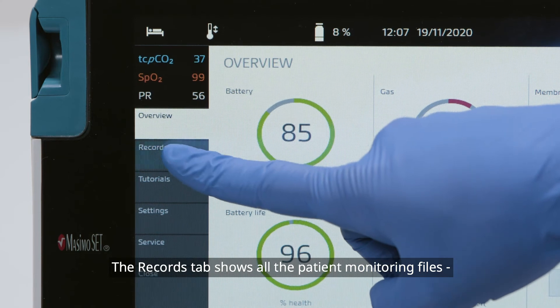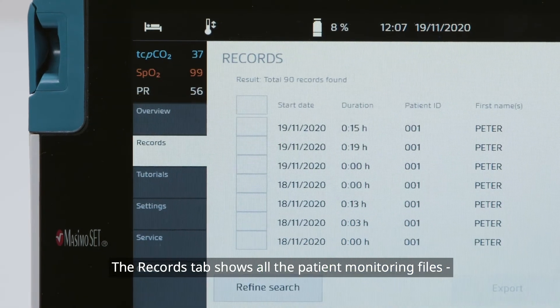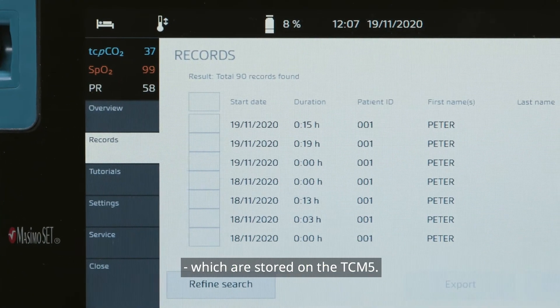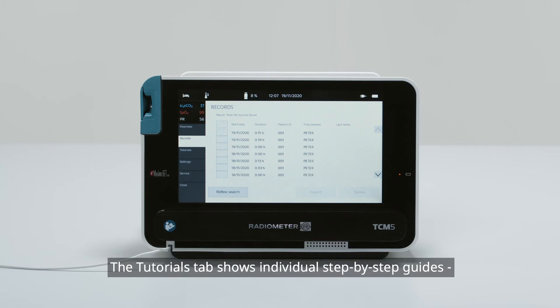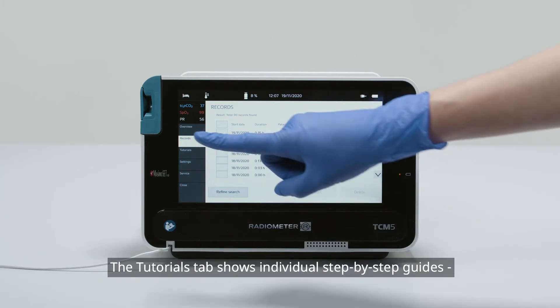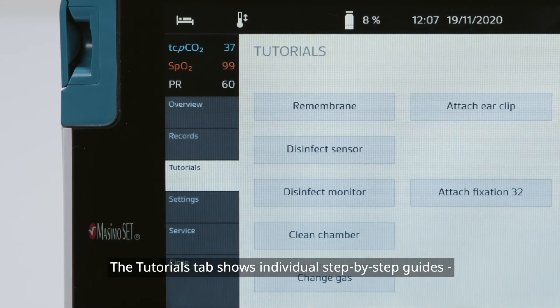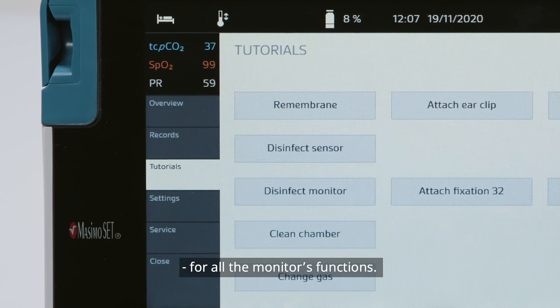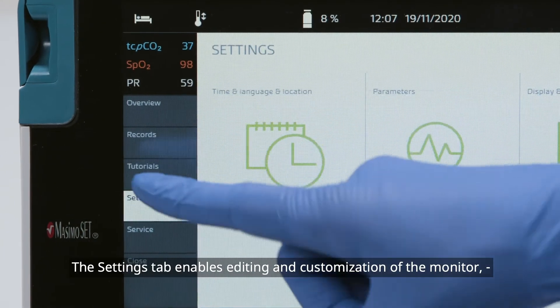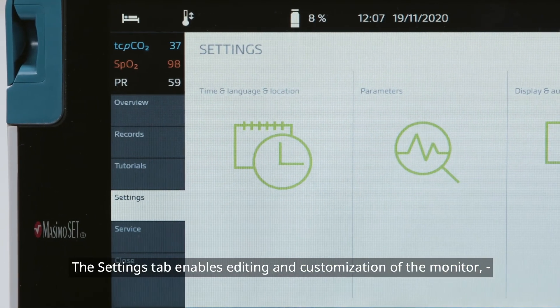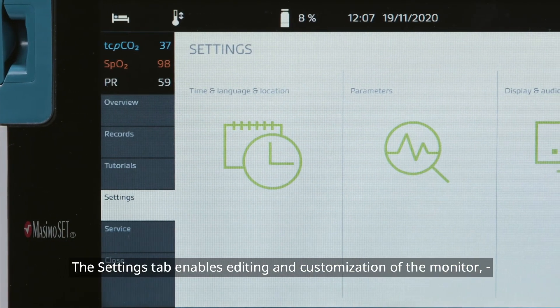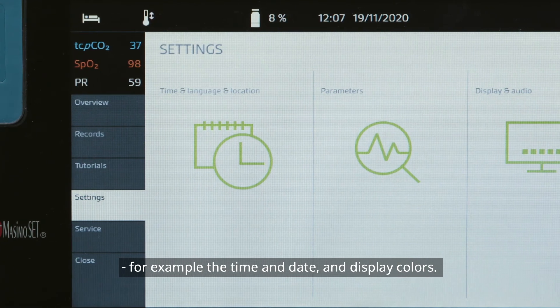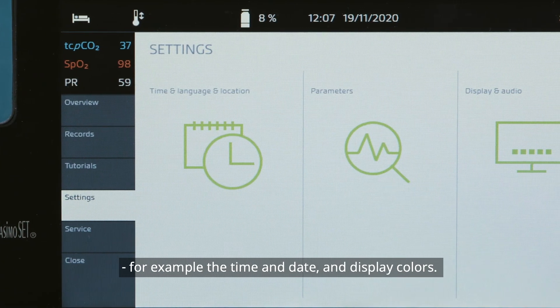The Records tab shows all the patient monitoring files which are stored on the TCM-5. The Tutorials tab shows individual step-by-step guides for all the monitor's functions. The Settings tab enables editing and customization of the monitor, for example, the time and date, and display colors.